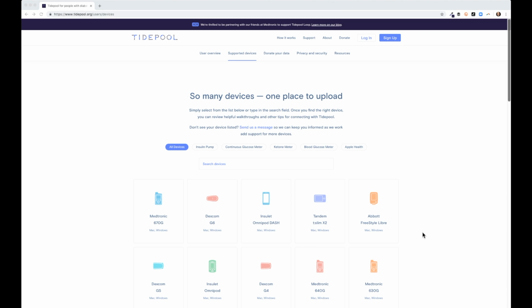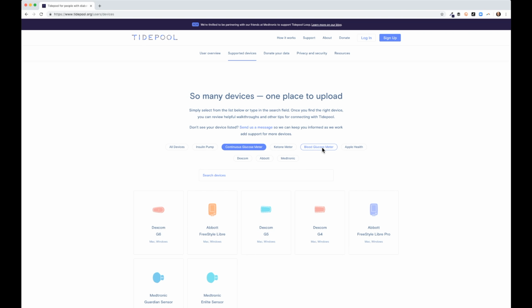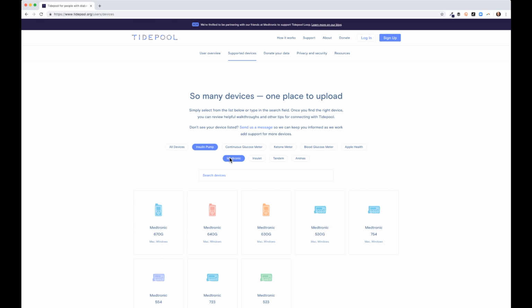Before we get into Tidepool Uploader, I wanted to spend a moment to review some of the devices that are supported with Tidepool. You can review all of our supported devices at tidepool.org/devices. On this page, you can filter for and identify all the different insulin pumps, CGMs, and blood glucose meters that are currently supported by the Tidepool platform. Specifically with insulin pumps, we support, among others, the Medtronic 670, 630, and 530G. From Insulet, both the original Omnipod PDM and the newer Omnipod Dash PDM. From Tandem, their entire suite of products, including the t:slim X2 running Basal-IQ. And while Animas is still around, we do support the Ping and the Vibe.